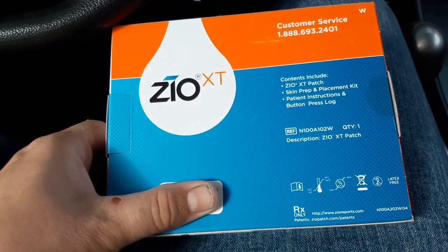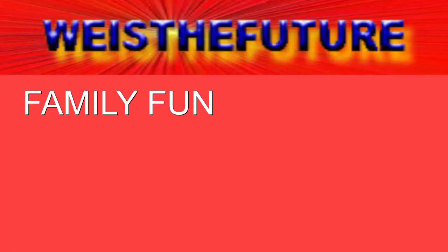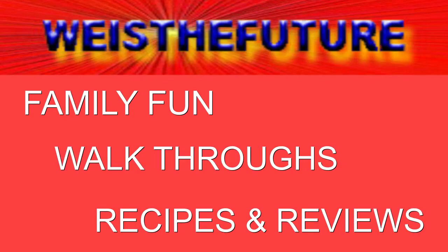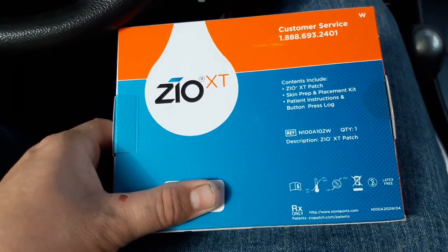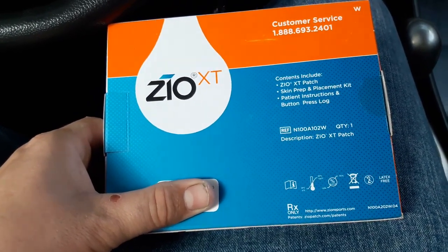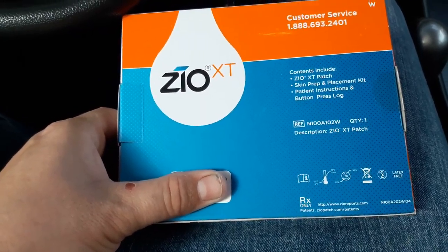EOXT EKG body patch. You can wear it up to 14 days. Once you're done wearing it, you put it in this box here and you send it back so that they can look at the data. Anytime that you have an issue, you just press down on the patch itself.